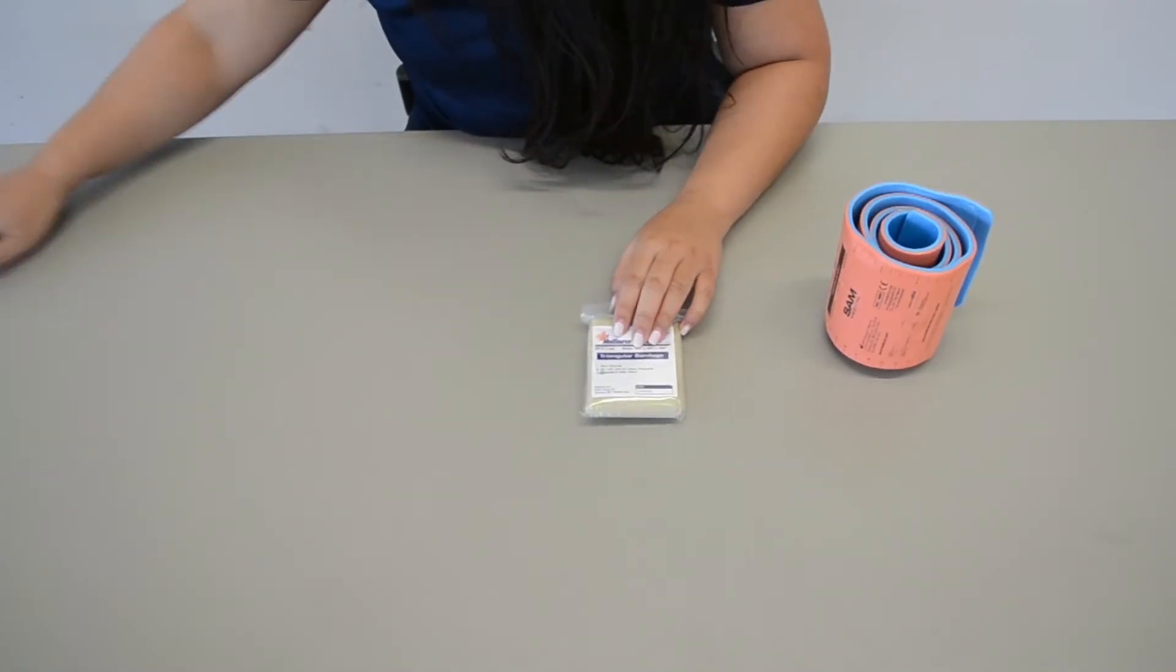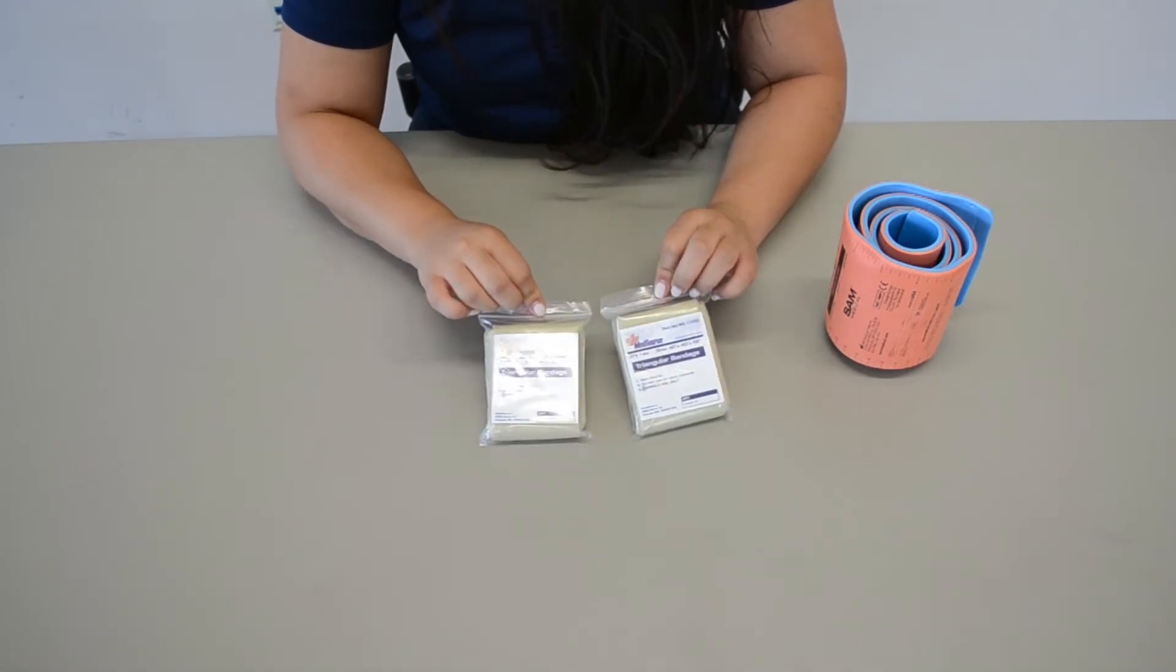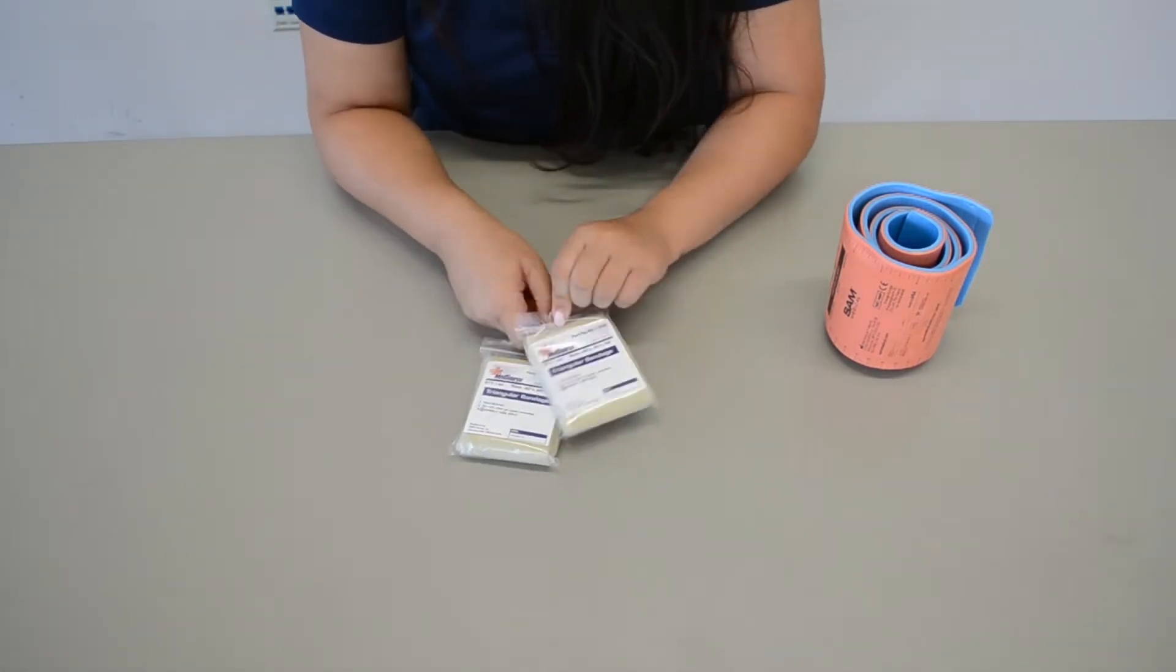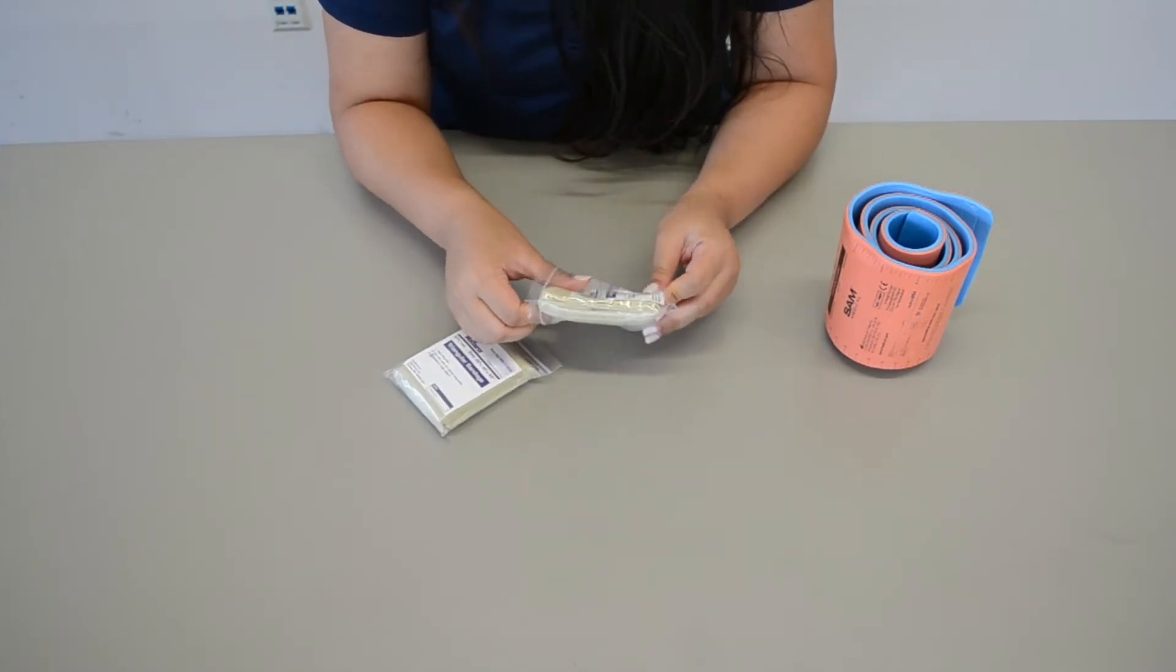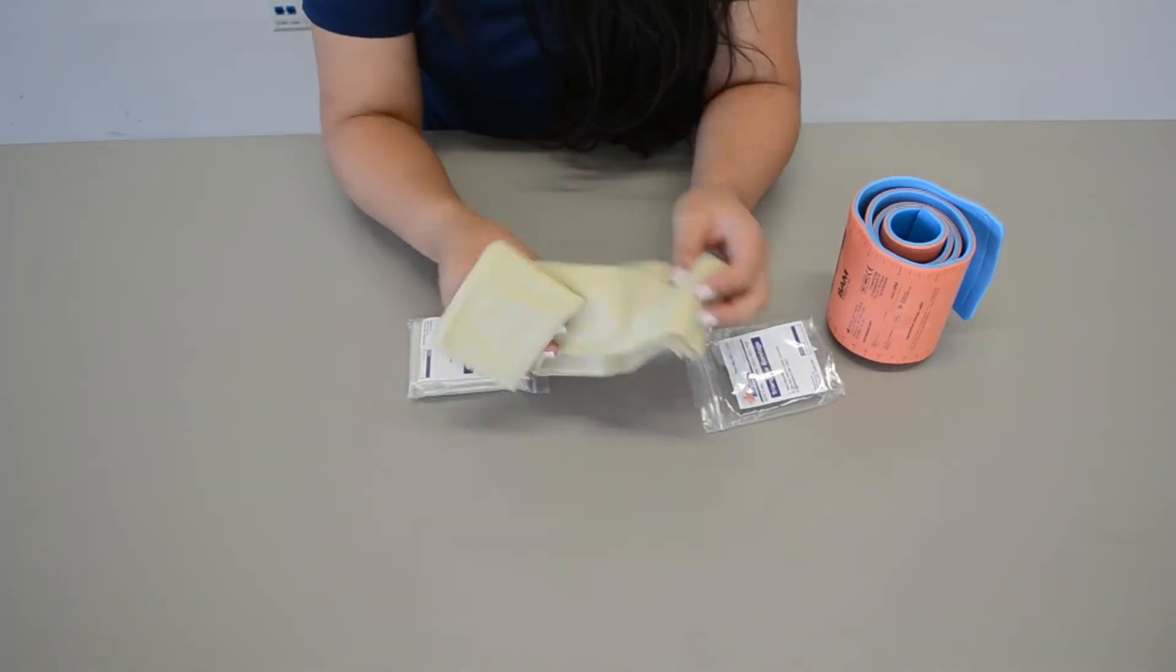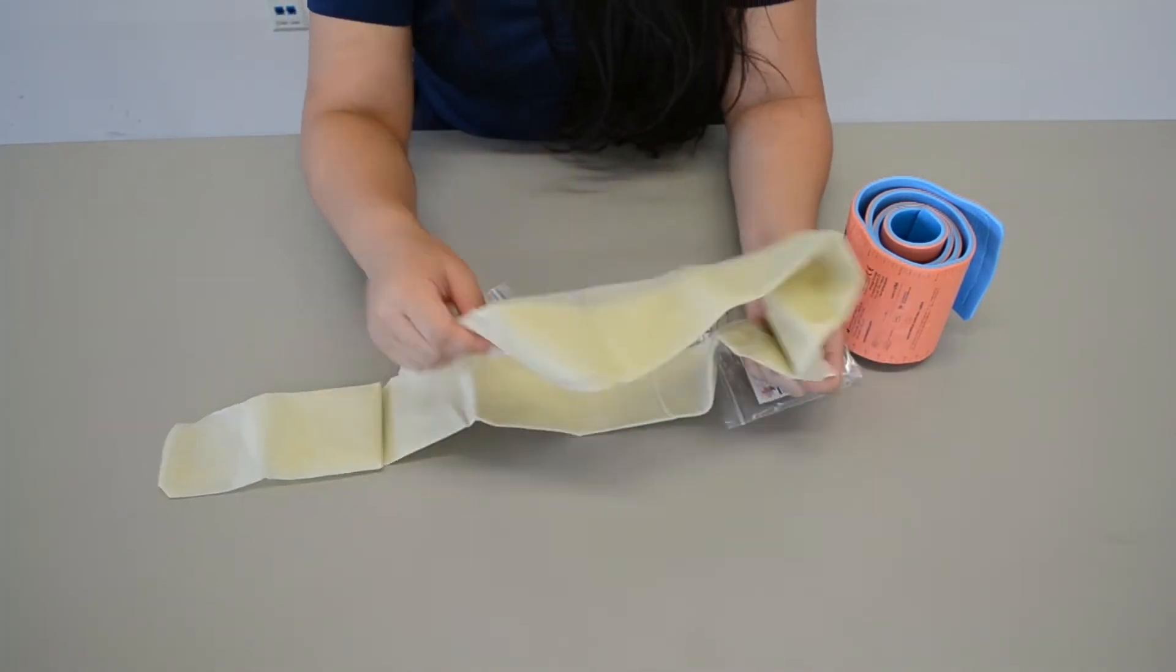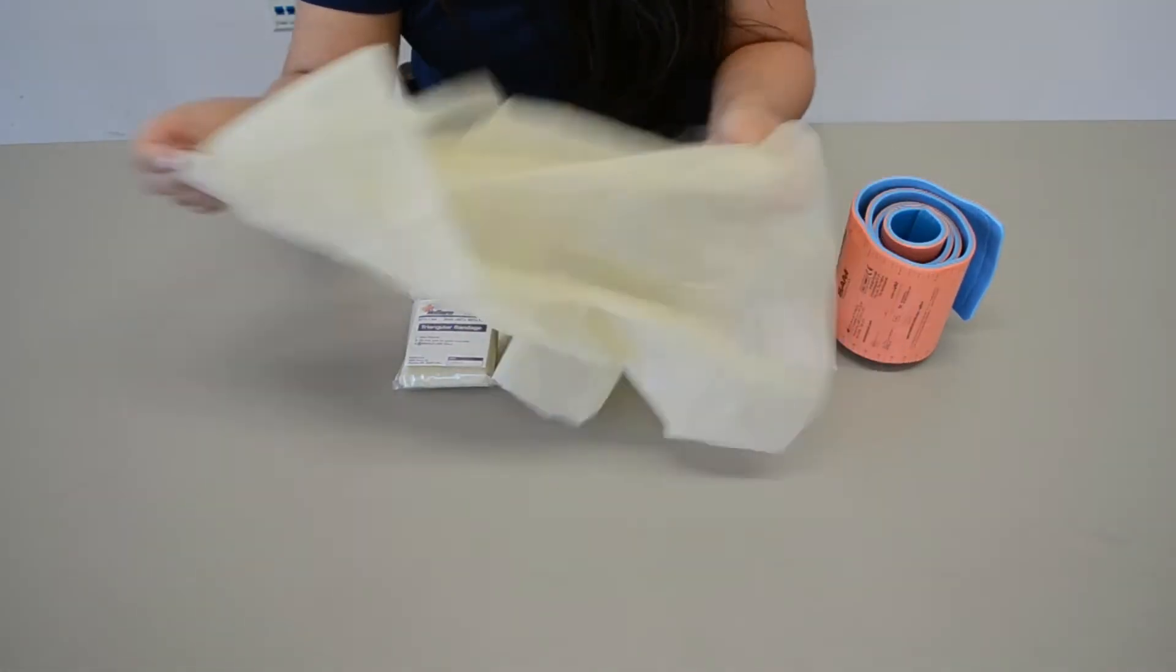And as for our triangle bandages, this is going to be something you use for when a patient has a shoulder injury. So they're going to come in packs like this. They're going to unravel, and there's some safety pins in there. So what you're going to do is you're going to open it up like so.